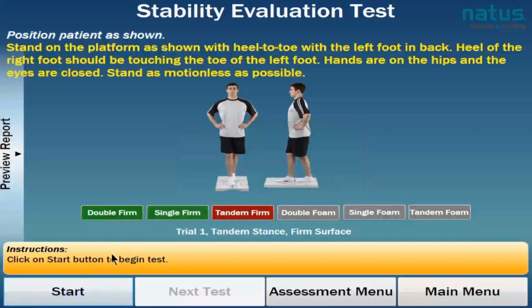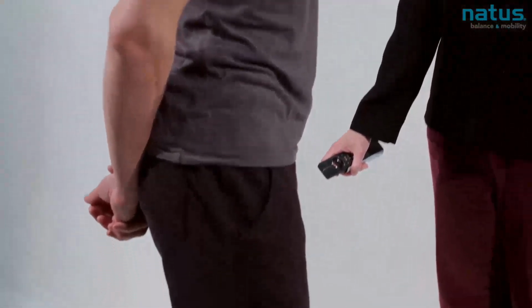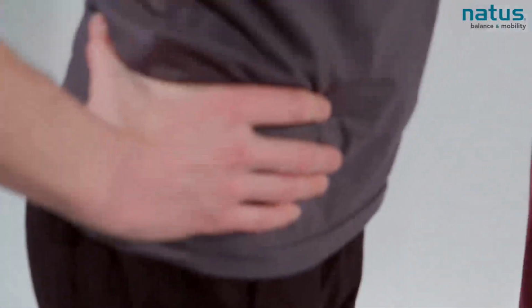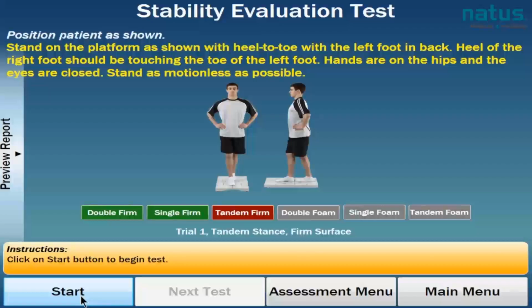Our next trial is tandem stance on a firm surface. So I'm going to have you stand with your feet in a line, left foot behind, right foot in front. Great. And hands on hips again. And I'm going to give you a practice trial. Go ahead and close your eyes. I'm making sure he's safe. If you feel unsteady, just open your eyes. Great, open your eyes. I can already see that he's more stable in this condition.